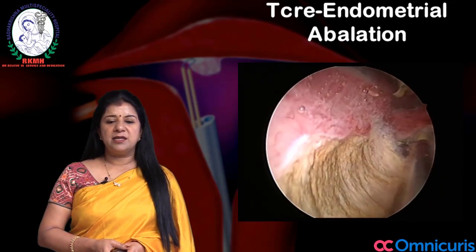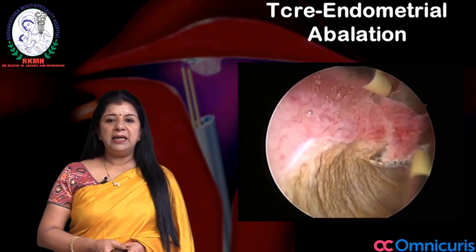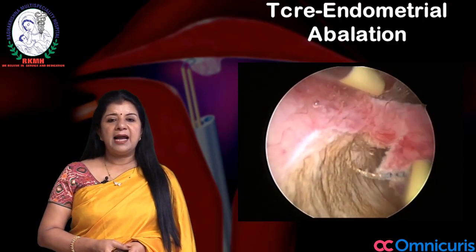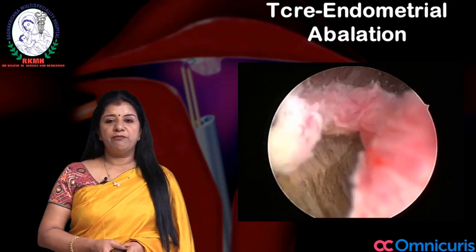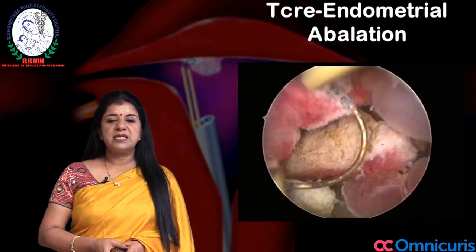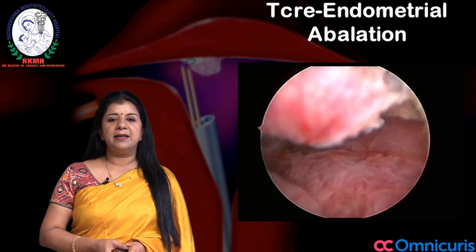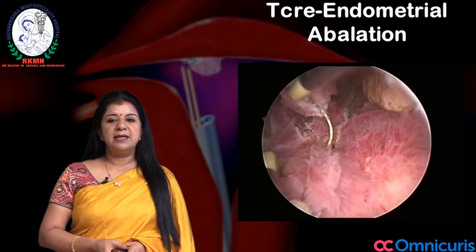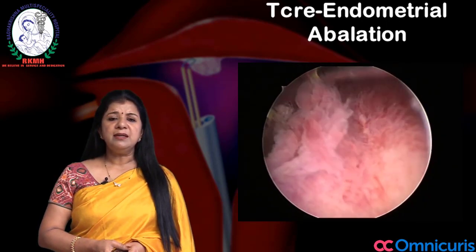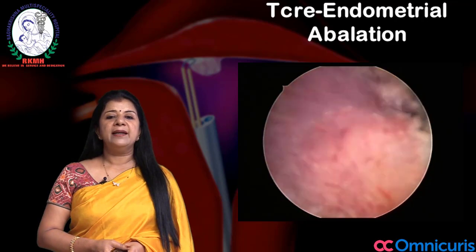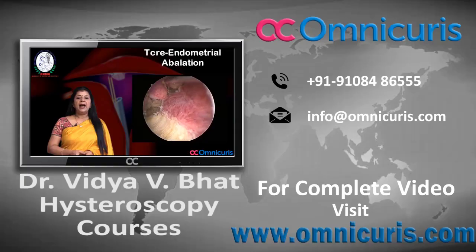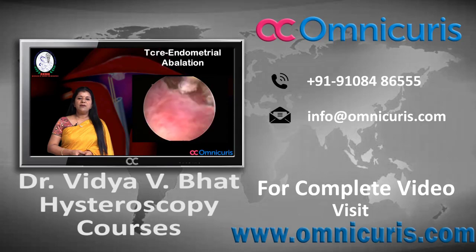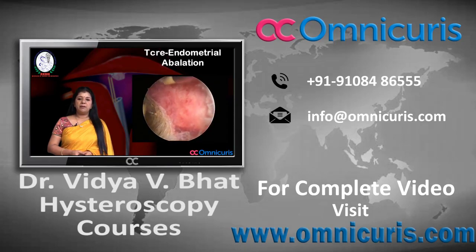As you go to the lateral wall from the middle, the lateral wall also is taken off, because as the uterus is enlarged in a globular pattern, part of the lateral wall is taken off as you do the posterior wall. Then you go to the lateral wall and take the loops, and you have to take loops throughout — that is from the fundus of the uterus up to the internal os.